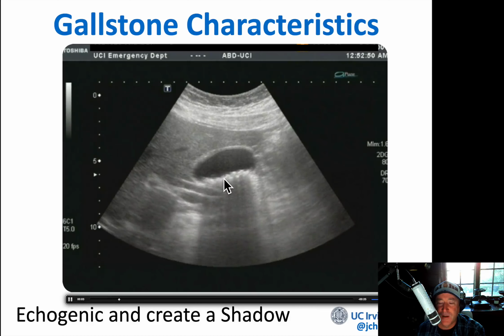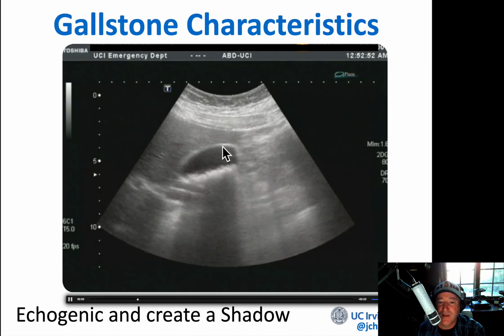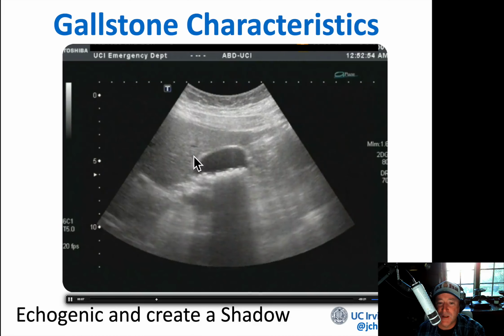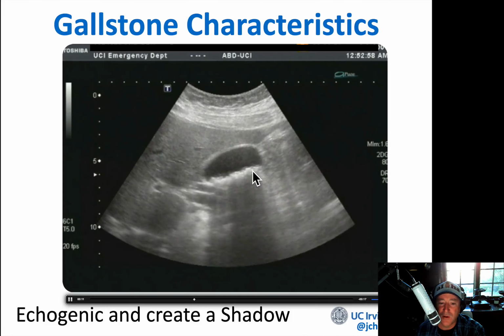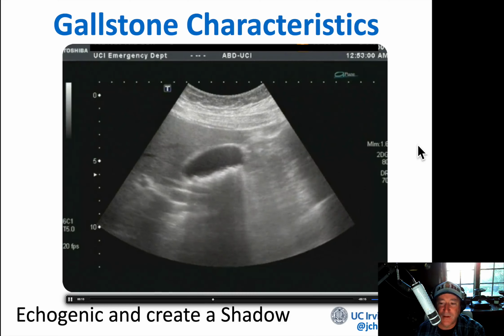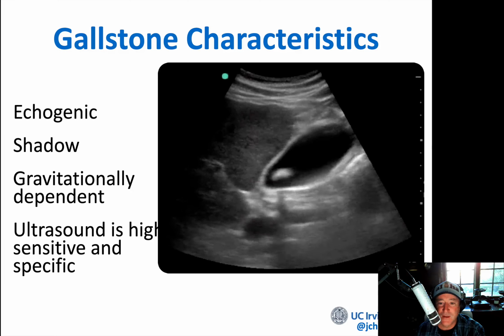Okay, so moving on. This is what makes gallstones so beautiful. You've got this gallbladder, you've got these gallstones here, and it all comes together with the shadow. It's such good times whenever you see these classic gallstones.